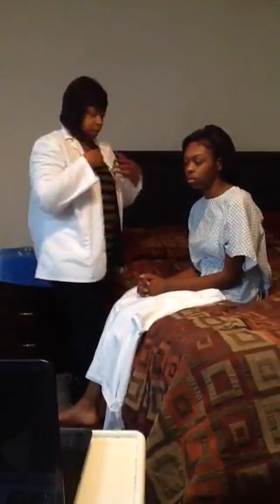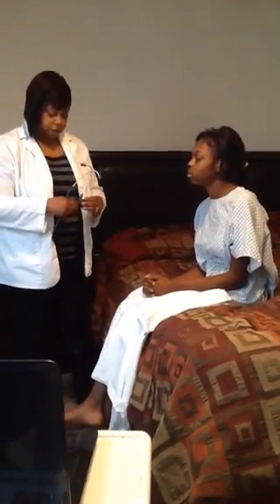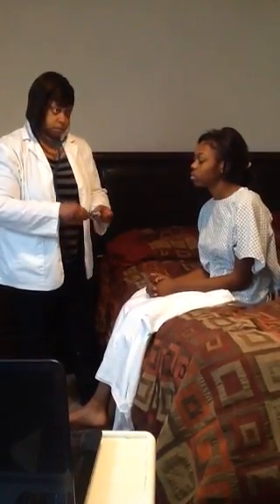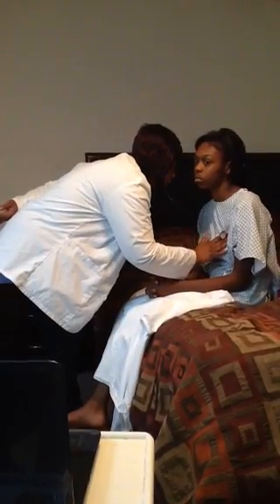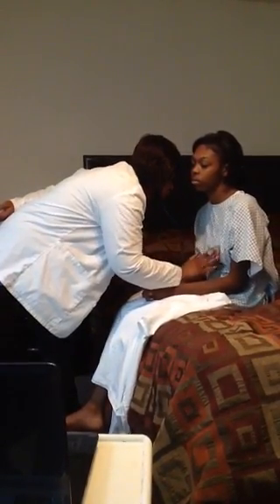And then I will auscultate over the heart sounds, first using the diaphragm. Aortic, pulmonic, Erb's point, tricuspid, and then mitral.